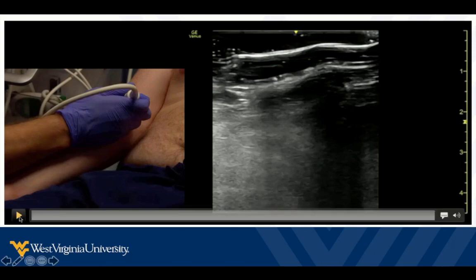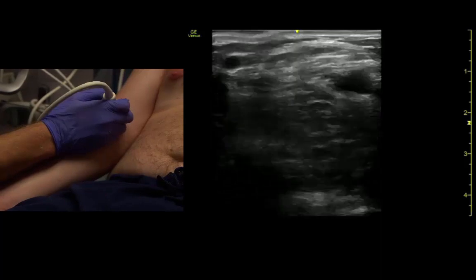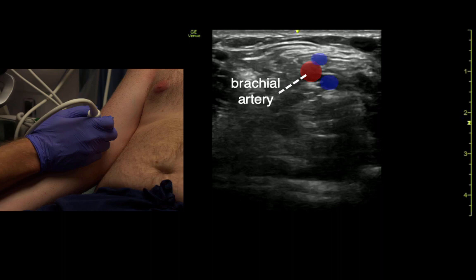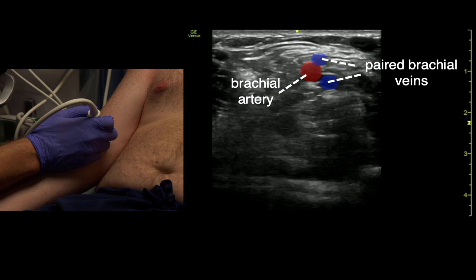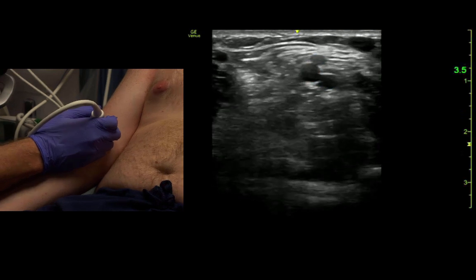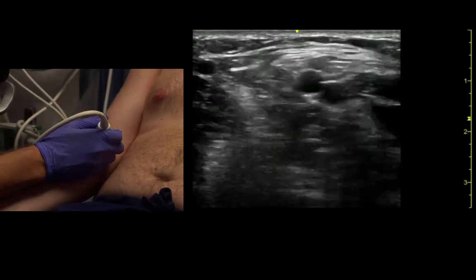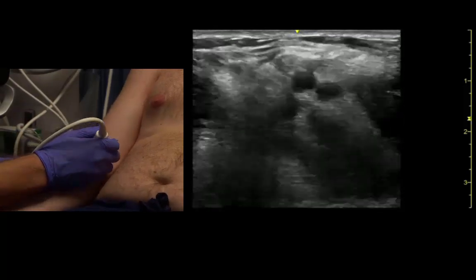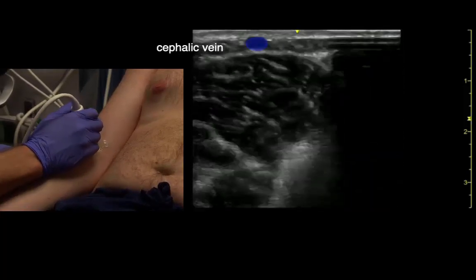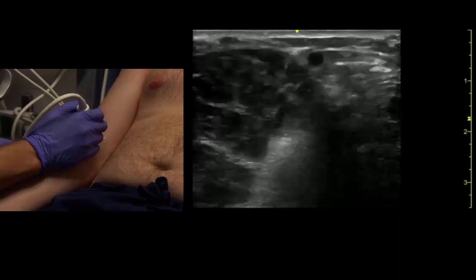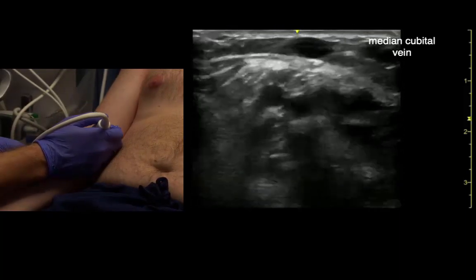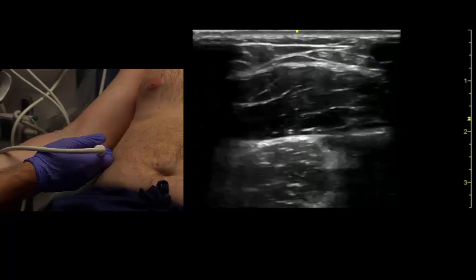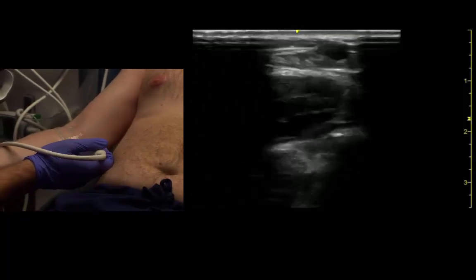To see in live action what that's going to look like — we'll find the artery. On the brachial artery, we should see the brachial veins right next to it, and they compress while the artery resists compression. Here's the cephalic vein, very superficial and compressible. That's the median cubital vein going over top, also really superficial. And that leads us to the basilic vein just over here.